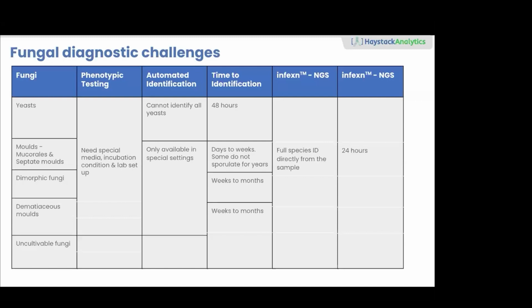Procalcitonin is low, counts are high, and the patient has all the risk factors for an invasive fungal disease. So he was almost right that it was a fungal infection. So, sir, you were right, and let me give you the right answer to it. We were able to provide him with that thanks to this technology.